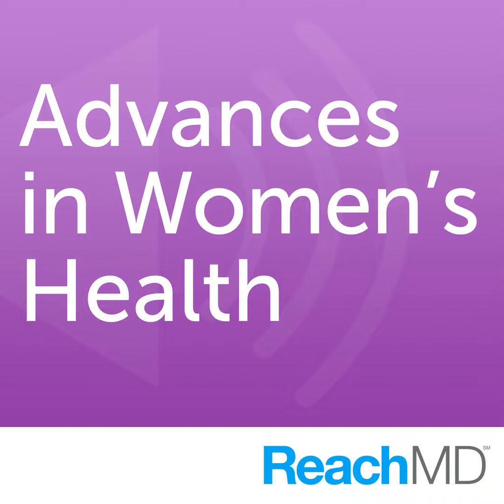Correct. For the cases that you would normally do in an open procedure, in other words, a uterus that's 14, 16, 18-week size, a 400 or 500-gram uterus that has large myomas, large fibroids, that you would normally do from an open procedure, that may be a good candidate for robotics. Patients that have extensive evidence of pelvic endometriosis, where you may have to dissect the ureters all the way out from the base of the pelvis to the bladder. Some of those more difficult surgical procedures that you wouldn't consider doing laparoscopically can be performed, in my opinion, more easily with robotics because they're more complex. And then it got its FDA approval in performing myomectomies.